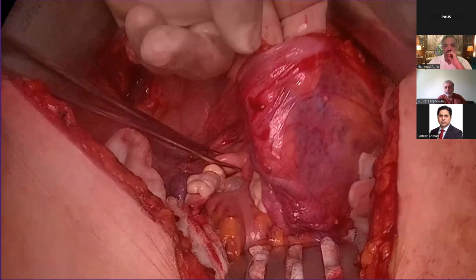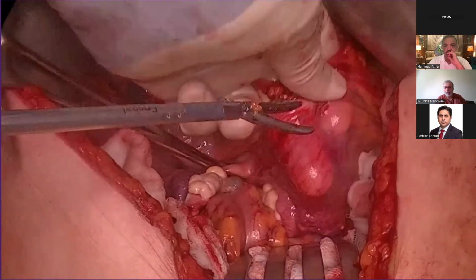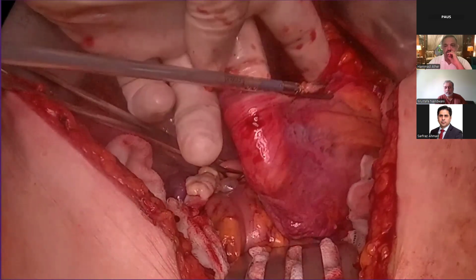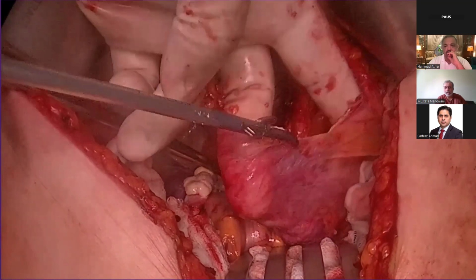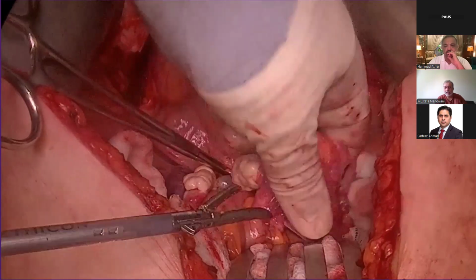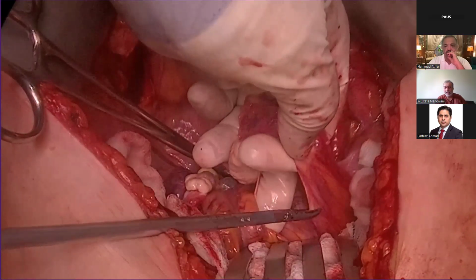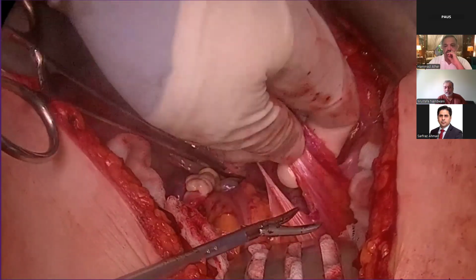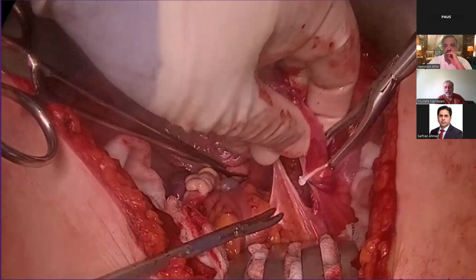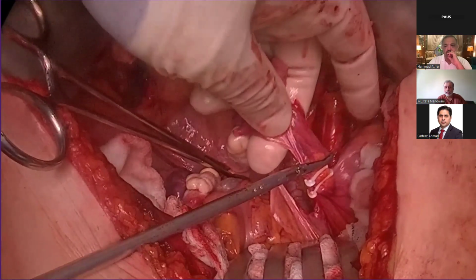When you hook it with your fingers, you will find these are the round ligaments, and then there is a broad ligament as well, which is going below. So you need to cut to get more exposure towards the lateral side. Now in the hand, there are the gonadal vessels. Before I cut, I usually put two Liga clips on top, and then one at the distal end, and then we cut it. It's up to you; you can tie these as well.